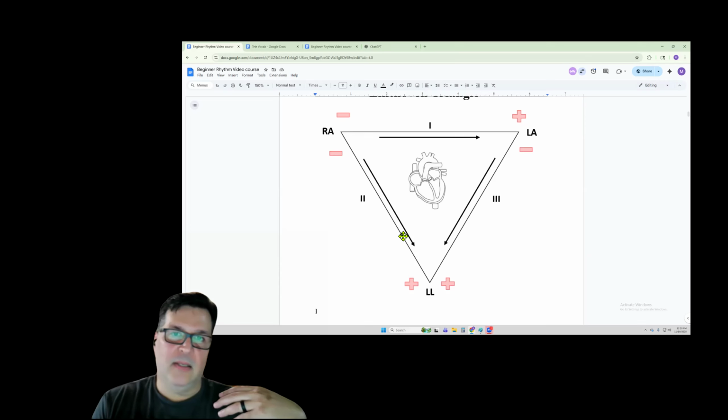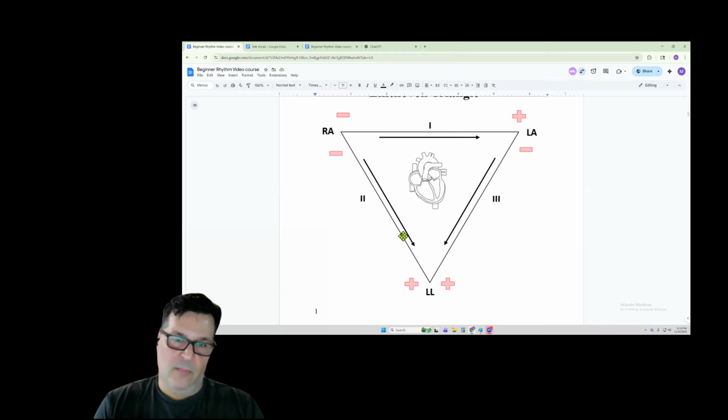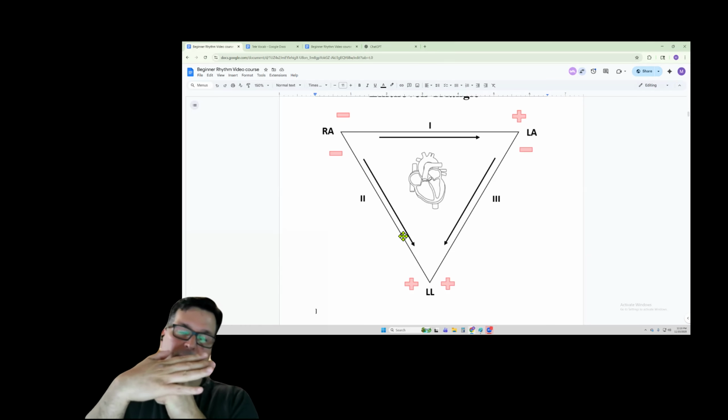Saying that, the brown lead is pretty static, that landmark. It's on the right side of the patient's sternum, fourth intercostal space down from the collarbone. So that's the space between the ribs, just off to the right of the sternum. What that does is it sits on top of the right ventricle. And the brown lead is unipolar, just one lead. And how it works is it measures the strength of the impulse.